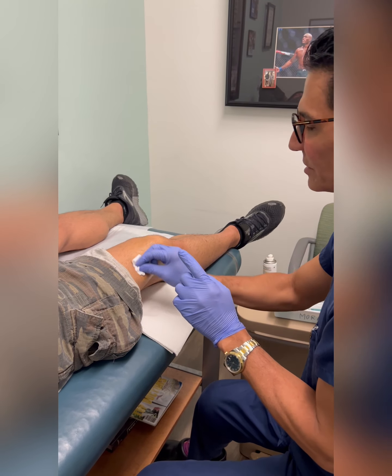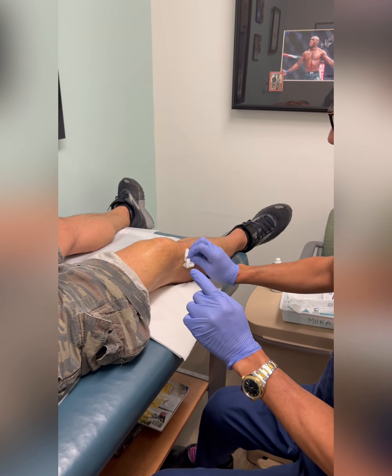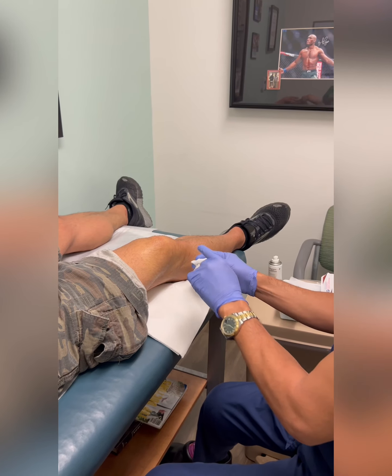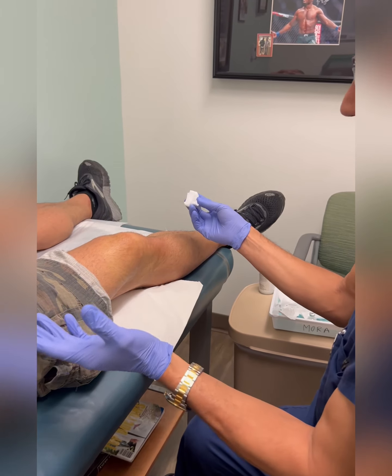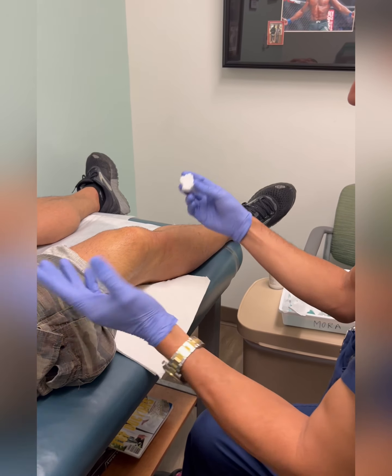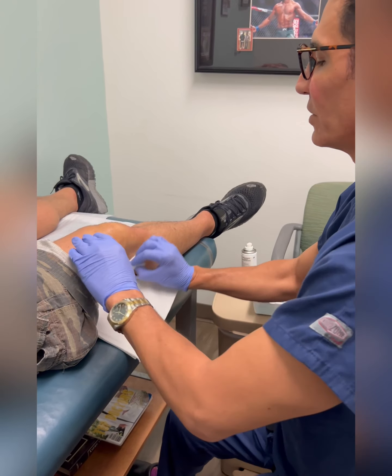When you have a swollen knee after an injury with an associated pop, there's often blood in the knee. The knee is swollen, so the patient can't flex without significant pain, and that loss of flexion prevents them from walking properly. First, I start with isopropyl alcohol to clean the knee off.